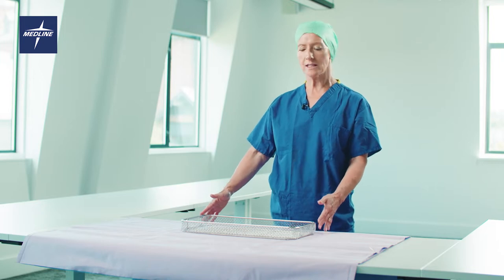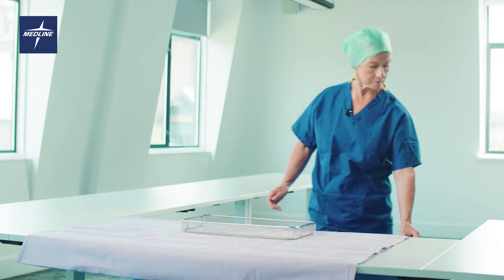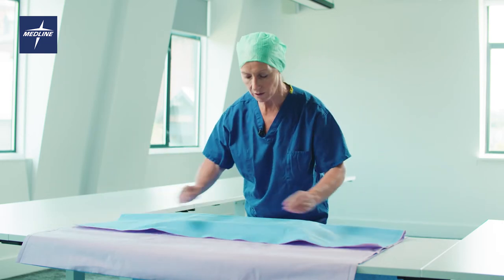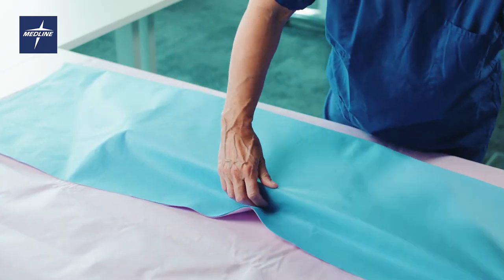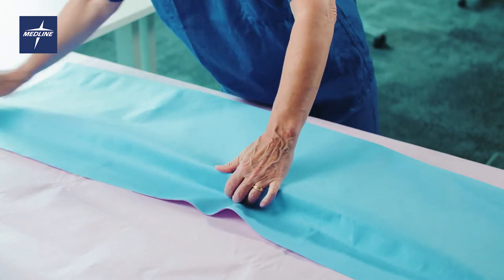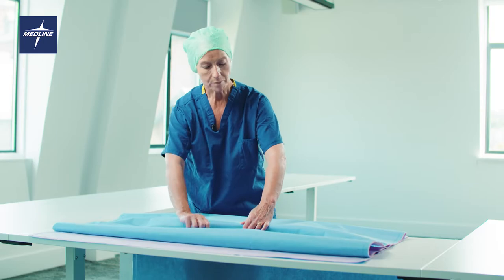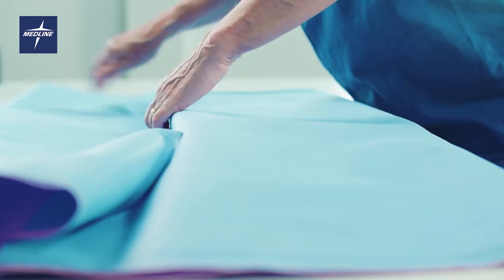Place the instrument set onto the tray wrap. Fold the tray wrap over to completely cover the instrument set. Bring the wrap over to meet the edge of the instrument tray.